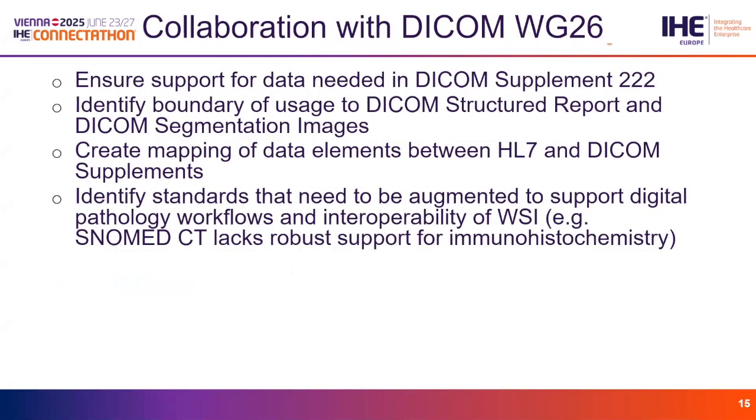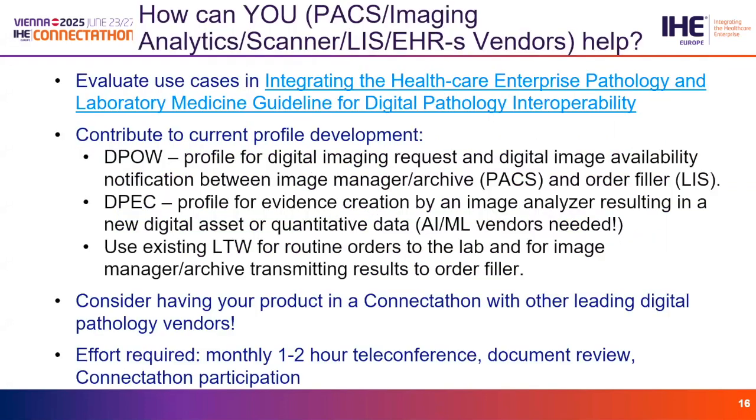We've been working really closely with DICOM Working Group 26 to ensure support for DICOM Supplement 222, which is structured reporting and image annotation. And we really are focusing in our digital pathology work, and Dr. Dash can talk more about that here in a second, to be able to create and have all the elements that DICOM needs for the header when creating a digital image.